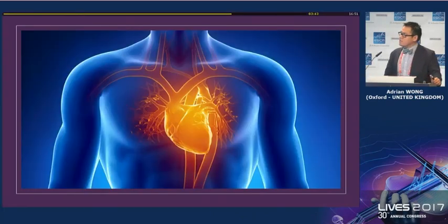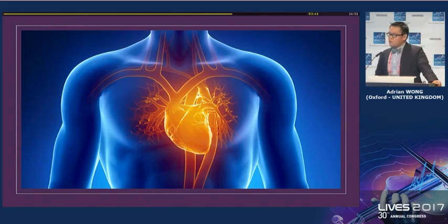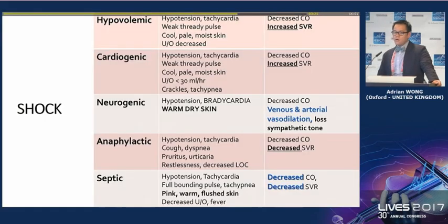Wrapping up the last bit of the talk, let's focus on the heart, because type 4 respiratory failure is due to cardiovascular instability. Lung ultrasound as a modality, like I said, is the only imaging modality that will allow you to do both by the bedside. You don't need a reminder of the types of shock.